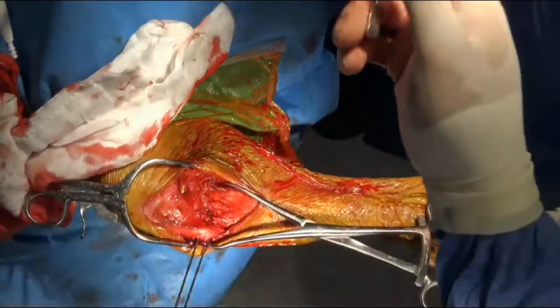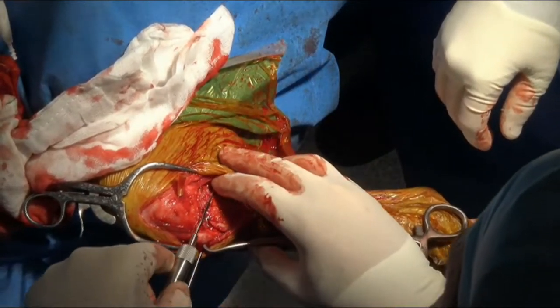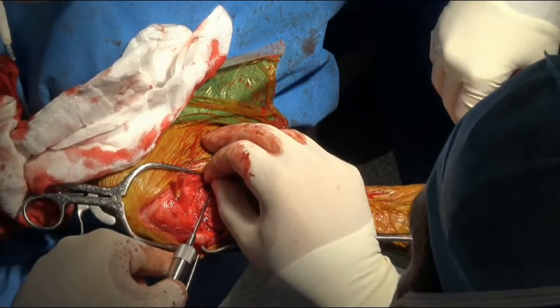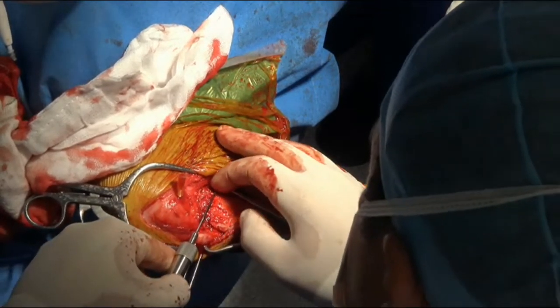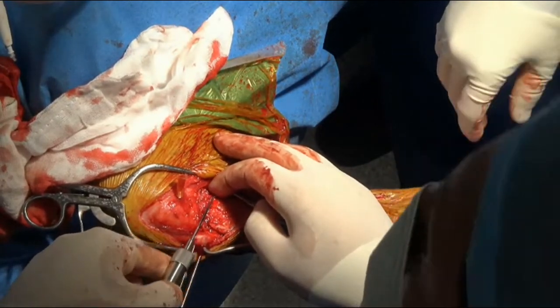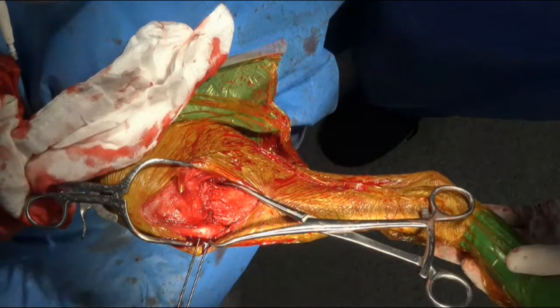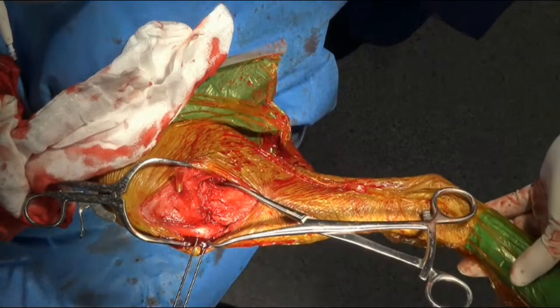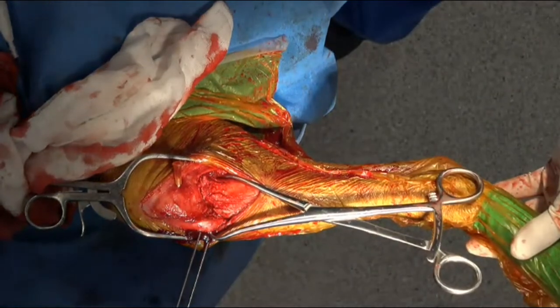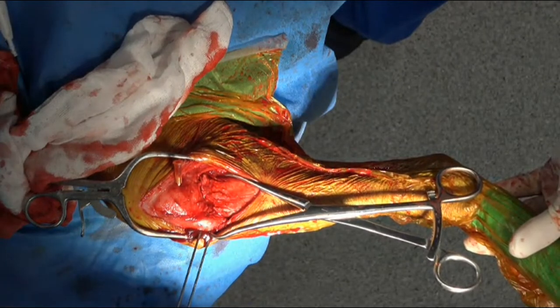I'm going to measure the length of this headless compression screw that we're going to use. I'm actually not going to put it down the center of the bone there. I'm just going to put it on the top here and estimate what the length is going to be. So I'm going to go with probably 45 or a 50 screw there, or a 48 even. I'll get a 48, please. Yep. So these headless compression screws, yeah, check the length. Oh, good idea.